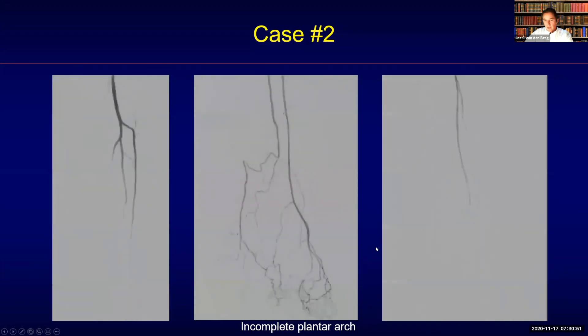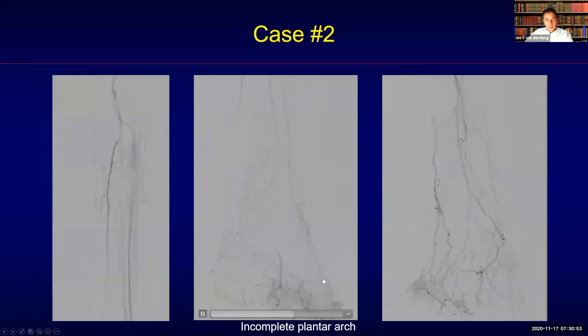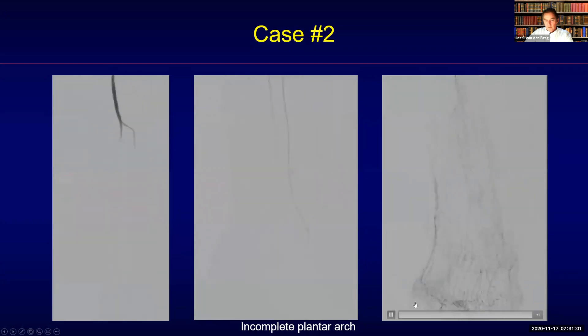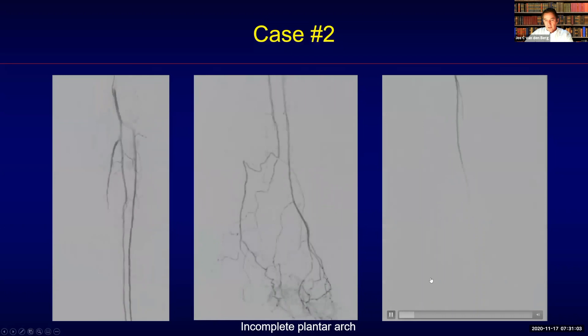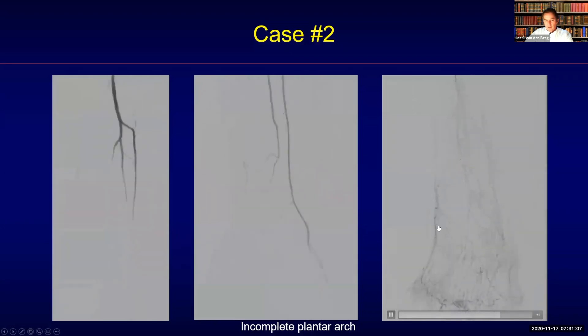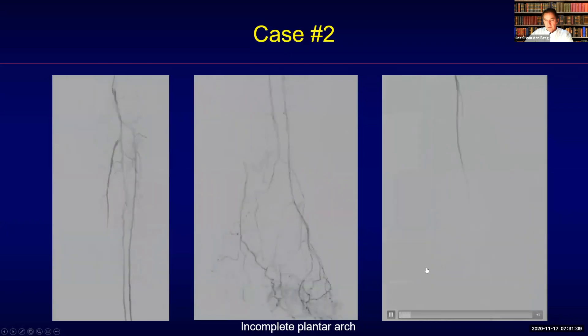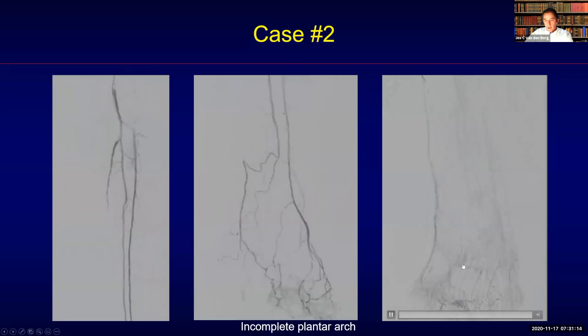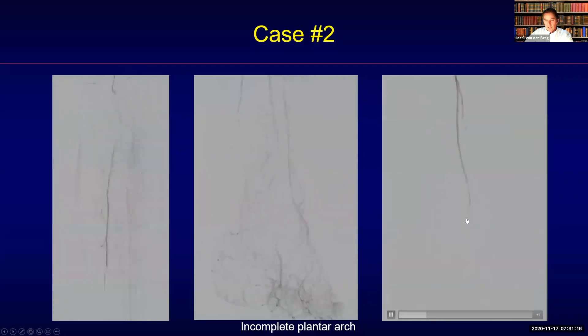This is mainly the reason why I want to share this case. With a lesion like this, we need to get blood to the head of the first metatarsal. You can already see there is actually a dual vascularization, both from the posterior circulation and a tiny branch coming off the dorsalis pedis that is stenotic in this segment.